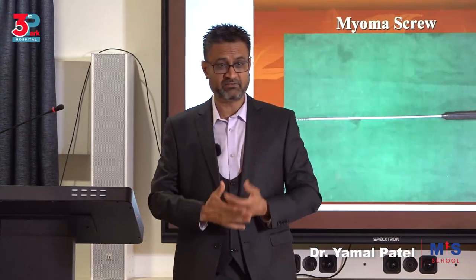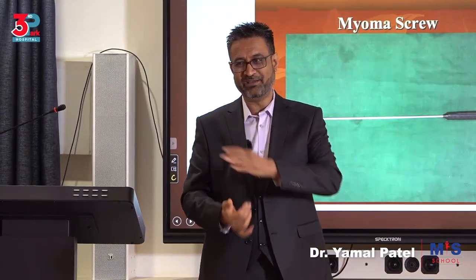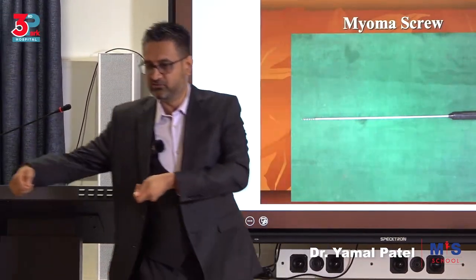I now do ipsilateral suturing. I told you, because of my shoulder. When I used to do this across the table, this hand used to get a lot of straining. And I used to do a lot of suturing, because I do lots and lots of laparoscopic myomectomies. When you do very many myomectomies, it requires a lot of suturing, you know that.